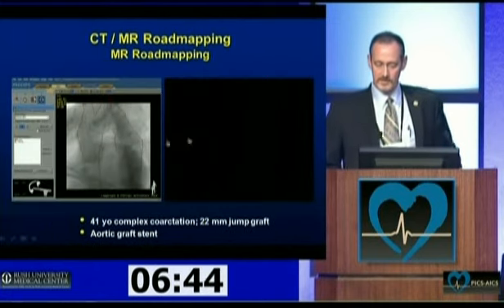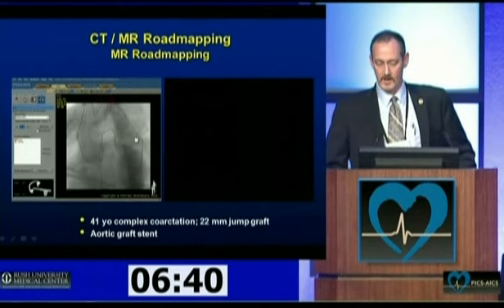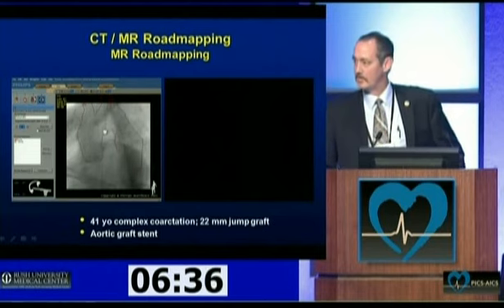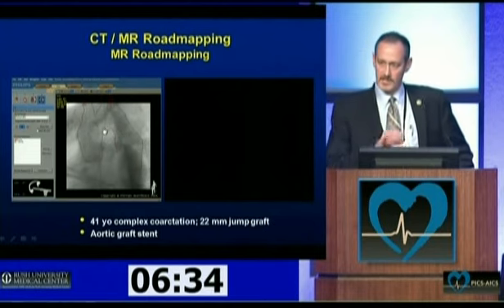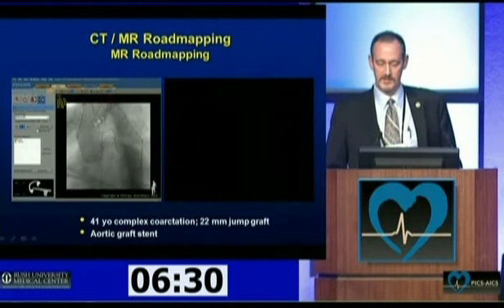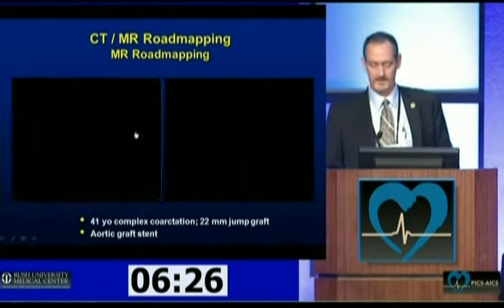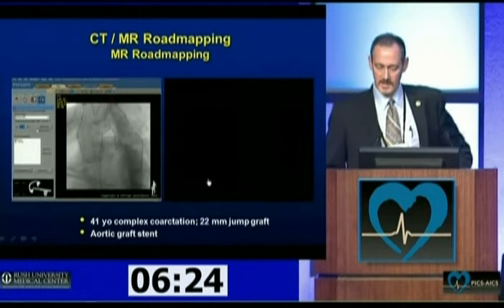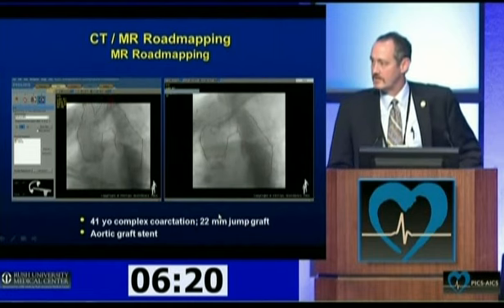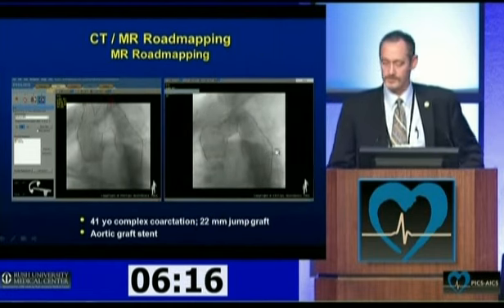For the overlay image, again, we use the outline form, but if you watch with the contrast angiogram, the outline is actually a fair amount larger than the conduit was. That's because with this technology, if you have two overlying portions of the same structure, you don't get delineation between them. The true arch was overlying this. So what we did was get back out of the system for a second, resegment out the true transverse arch, and then the anatomy and alignment were very close to what we used for stent delivery.